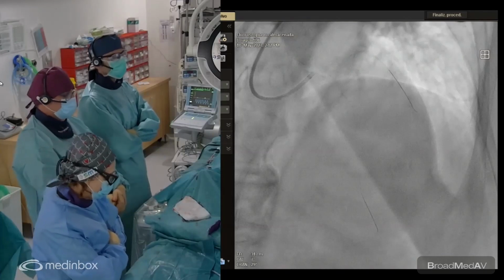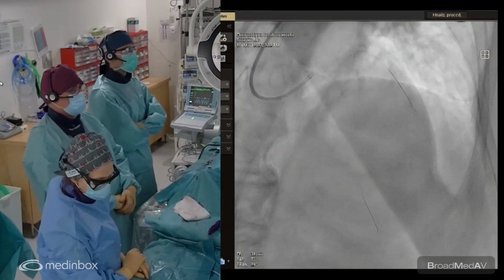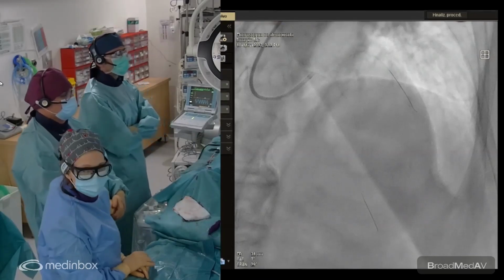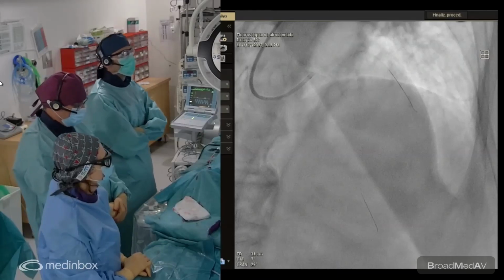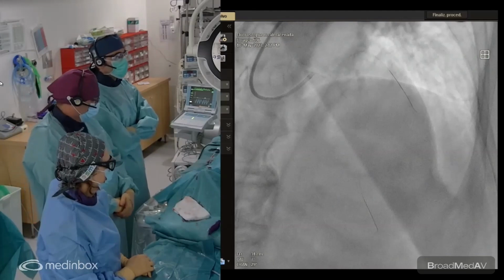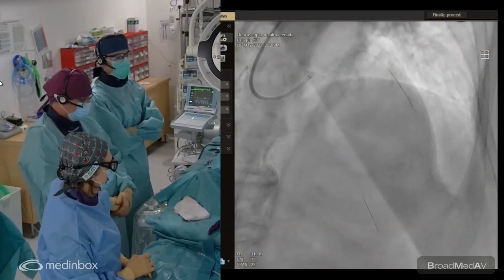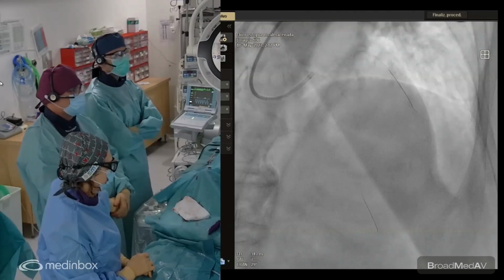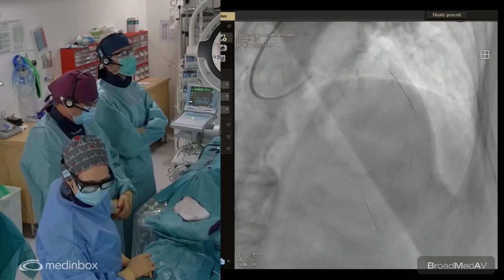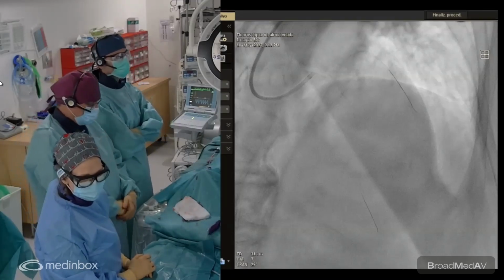We are doing some more angios now because it has some tortuosity. It's a calcified lesion. It's also a bifurcation, but the side branch is occluded. So we are going to forget it and try to minimize the contrast volume. And we are trying not to use atherectomy devices because of the left ventricular dysfunction, and try to see if with semi-compliant or non-compliant balloons the expansion is okay.